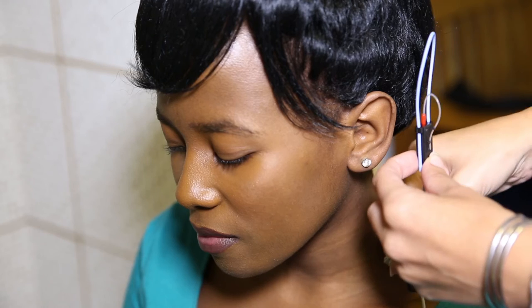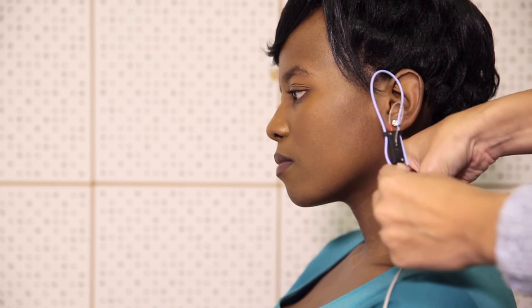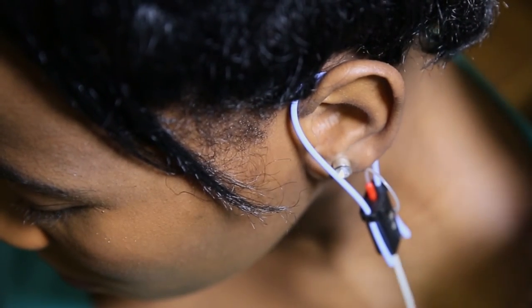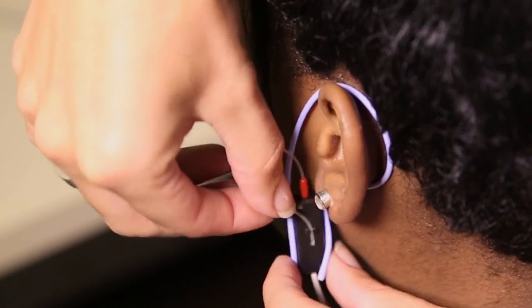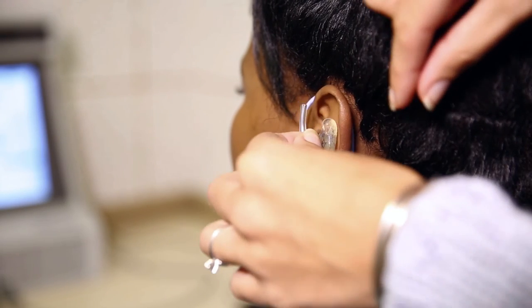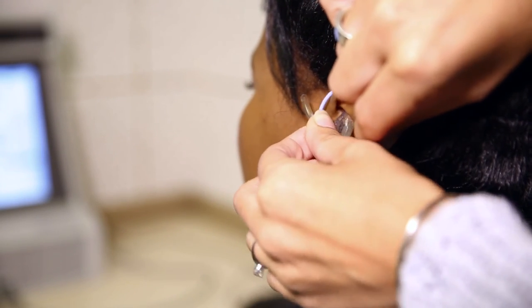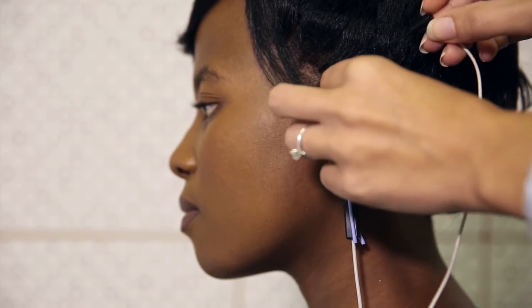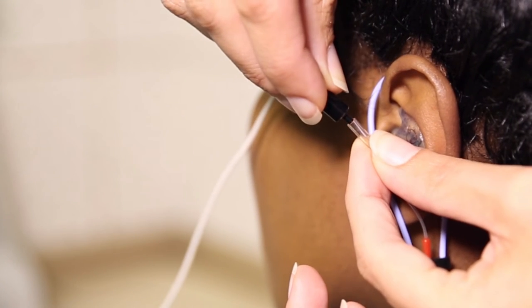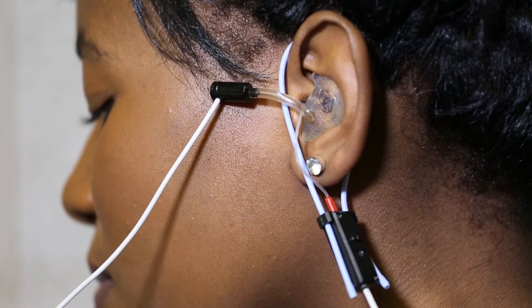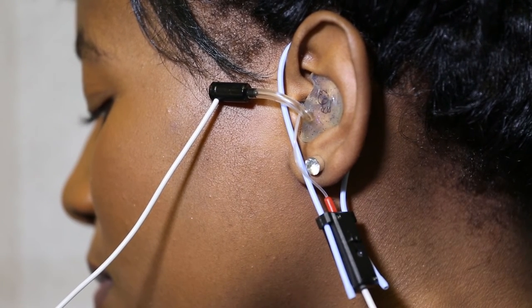We then attach the probe microphone to your client. And then place the blue loop over the test ear like so. And place the probe, which is attached to the real ear microphone, into the ear. We then place the mould in, being careful not to squash the probe.